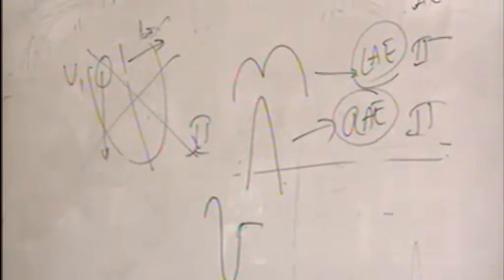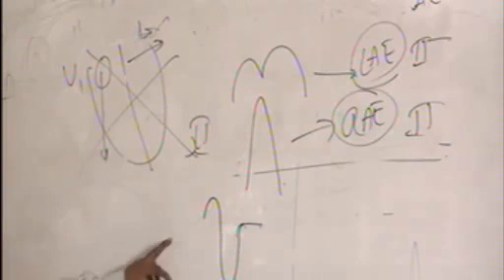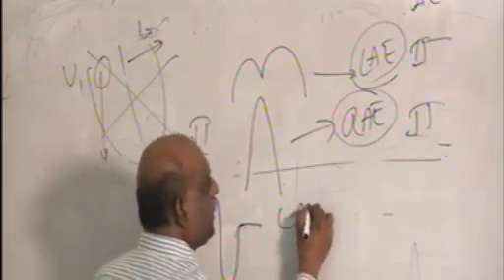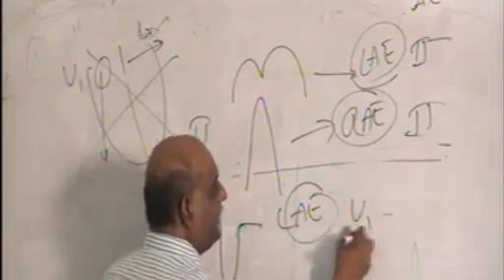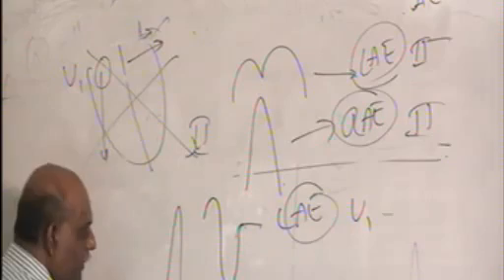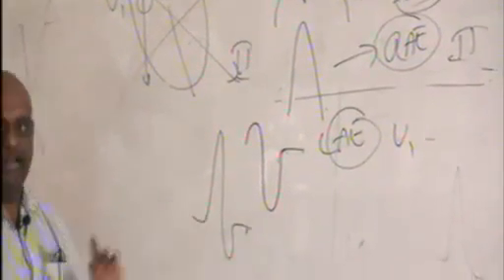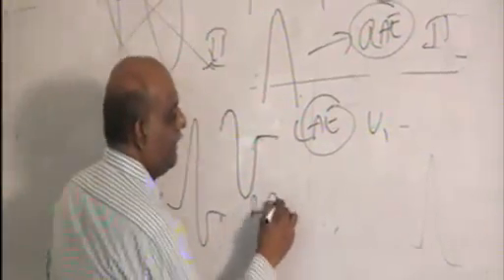Which chamber enlargement? Wait, stay. Left atrial enlargement. Which lead are we talking about? Lead V1. Then initial positive and the same negative means right atrial enlargement. And which lead?